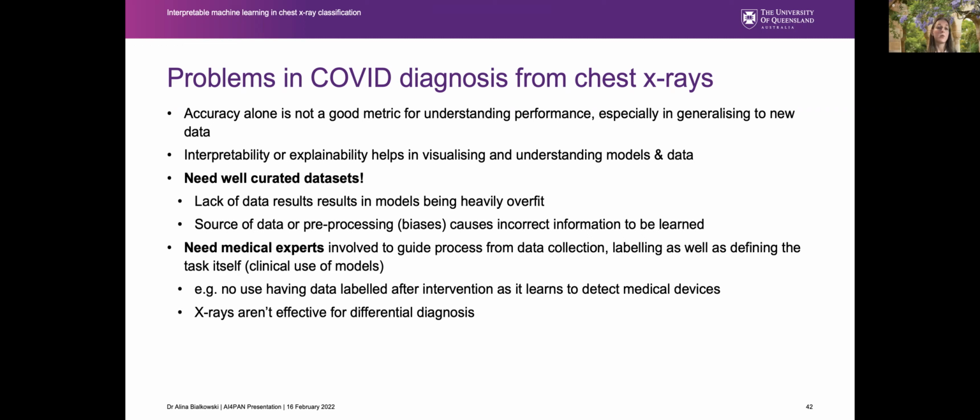And I think even more importantly, we can't have machine learning researchers perform this modeling alone. We really need medical experts to guide the full process of a task, all the way from data collection to avoid those issues with incorrect labels, as well as contamination of different data sets appearing multiple times, as well as defining the task itself.